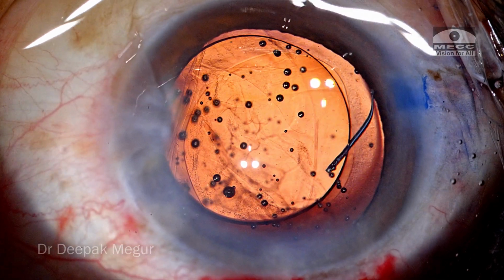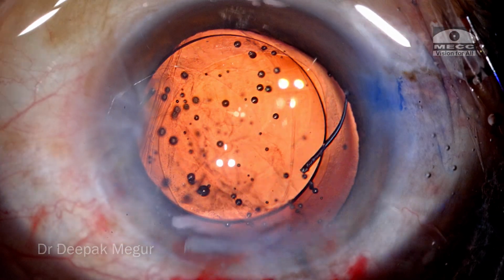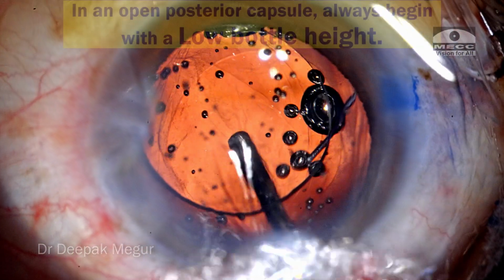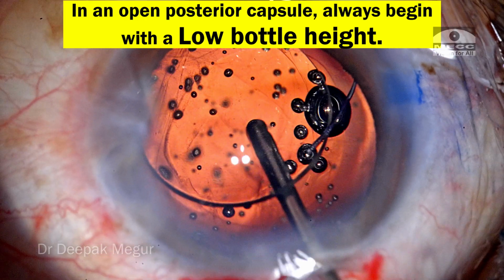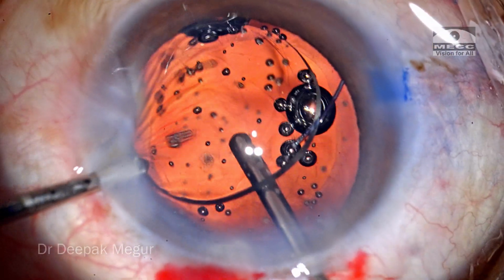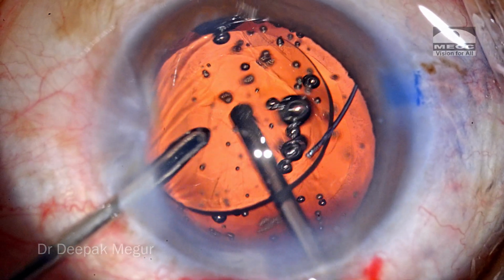Before achieving the optic capture, I would want to go ahead and remove some of the OVD which is there behind. In a vitrectomized eye, when we want to go inside, again mind the infusion. See, I'm going in with my cutter alone. There is no infusion now. After a couple of seconds, the infusion is being introduced into the eye, again with the lowest possible bottle height.